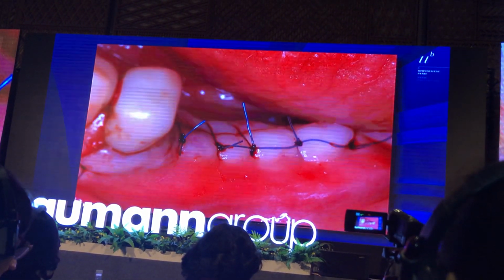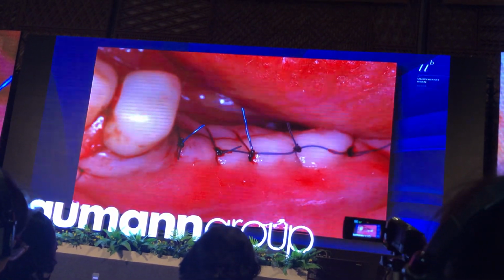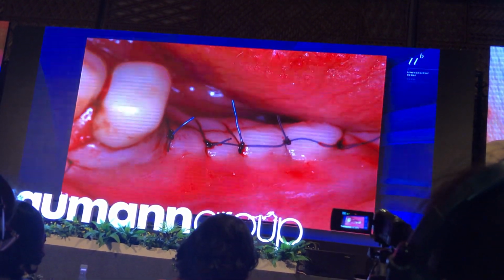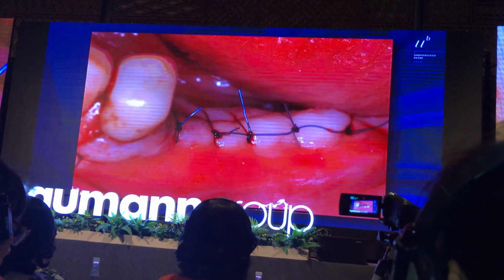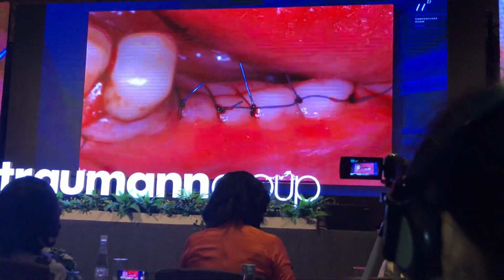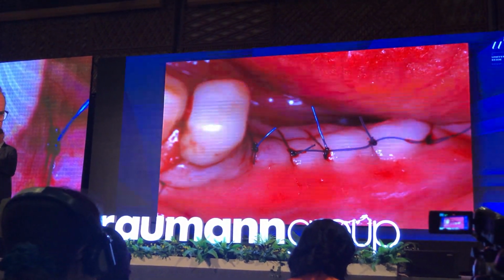When you hit the nerve, patient has a problem in the mental nerve here. So be very careful. I'm also very careful to do an incision of periosteum in the lingual aspect. I know that Istvan Urban shows that all the time, but that's very tricky. Because when you hit a blood vessel in the sublingual area, then you can get major bleeding, so be very careful. Don't do that with a blade there. Take a 2x2 and just stretch, and then you can stretch the flap a little bit. So this is the tension-free primary wound closure. So I told the patient, no, we are waiting. It's a big defect, we'll see.